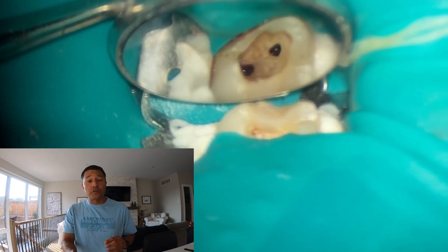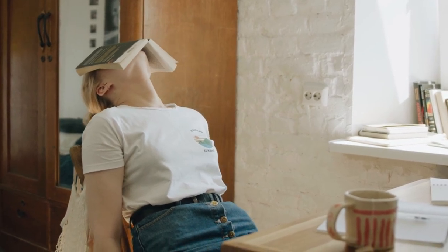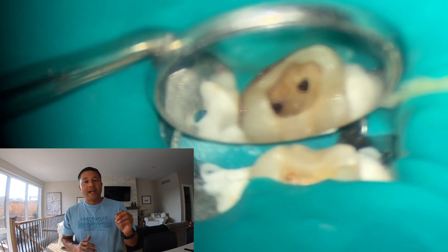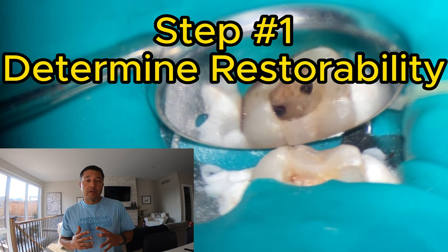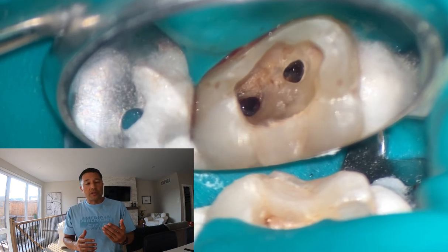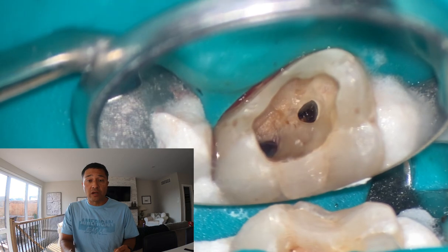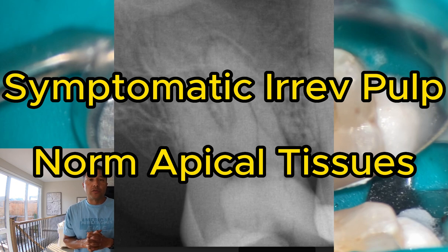I wanted to share this case with you because it really reminds me of when I was a brand new dentist or even under five years. This is a maxillary second molar, and this is one of our students from a course a few years ago. What had happened was they had removed all the decay from a maxillary second molar — that's the typical stage, you remove all the decay and see if the tooth is restorable. They finally did all the restoration, beautiful restoration, beautiful contact, and then it was about time to tackle the root canal. The tooth was diagnosed with symptomatic irreversible pulpitis with normal apical tissues.